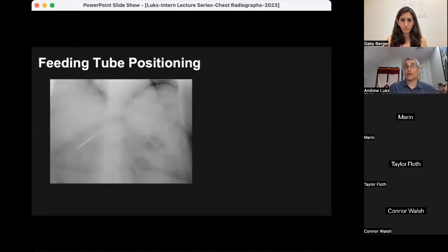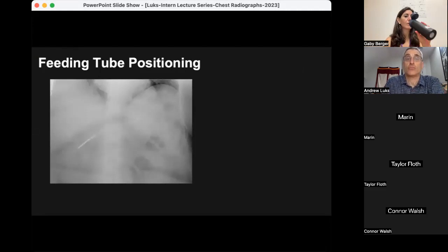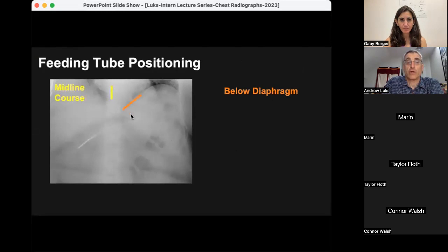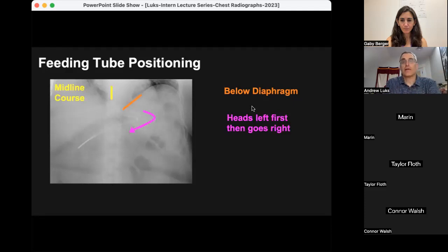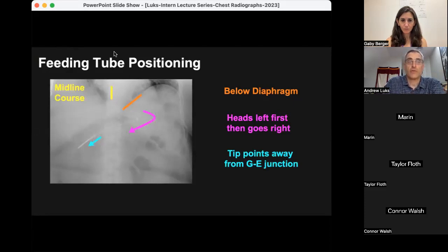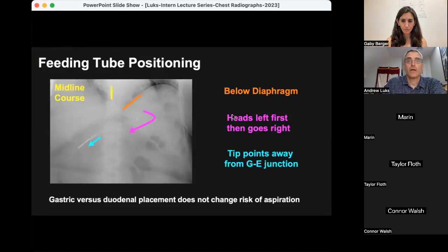For feeding tubes or nasogastric tubes: they should come down the midline of the body all the way, then curve below the diaphragm, usually heading to the left side of the patient's body and then curling back to the right, with the tip of the catheter pointing away from the gastroesophageal junction — that's an ideal feeding tube placement. If you ever see one of these feeding tubes breaking off the midline in the chest and heading left or right, it's likely in one of the bronchi and needs to come out. Don't stress too much about whether the tip is in the stomach or duodenum, as it does not change the risk of aspiration.